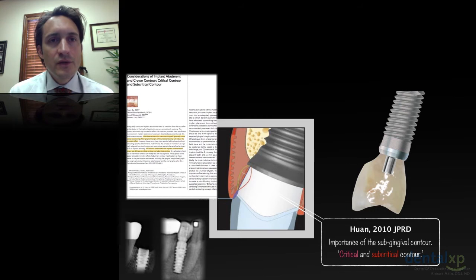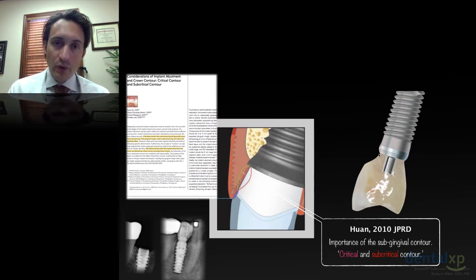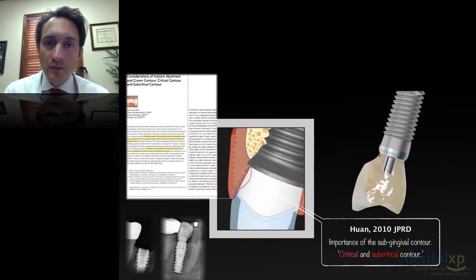As you go into a situation like this, where we have a convex subgingival surface, you will begin to see marginal gingival creep apically. It happens. Conversely, if you make sure that you allow for this concavity, you can see facial marginal gingiva become more coronally positioned. And I've heard lecturers on Dental XP talk about this. I've seen it in my own practice where we remove temporaries. That's what's great about them.